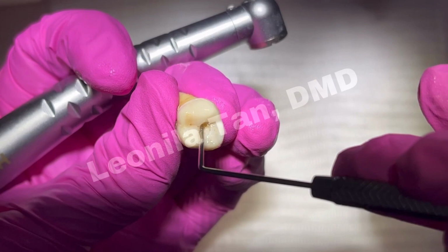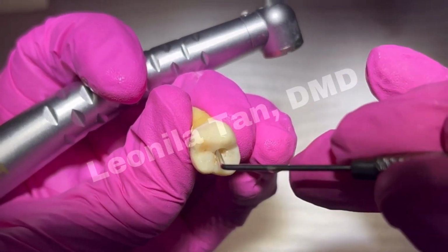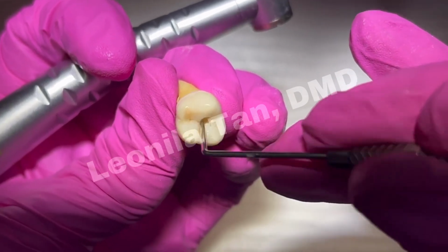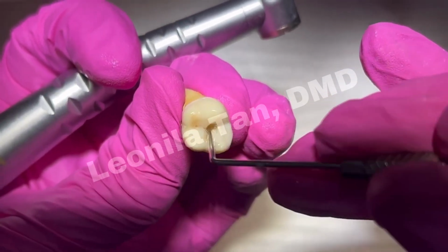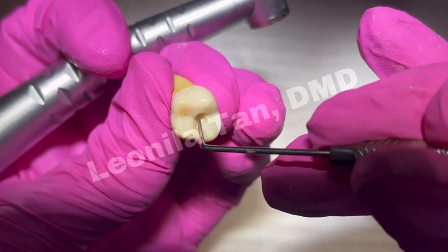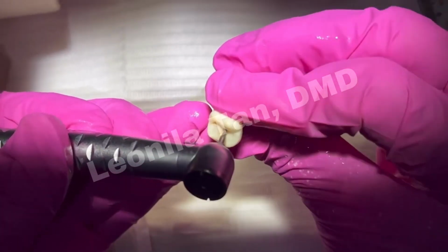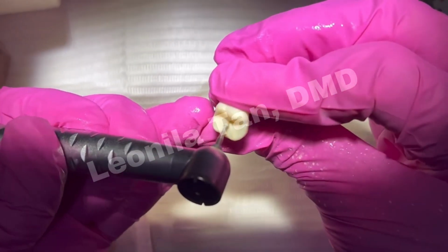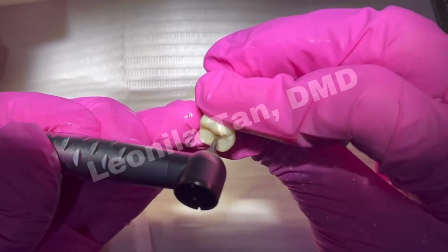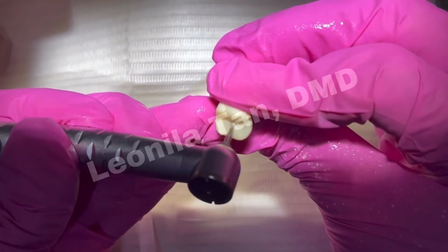At the same time, you want to probe, or you want to feel the area where your Explorer wants to enter, because the roof of your chamber is now thinning out. As I said, you look always at how much of your burr is still out. You're still at that safe depth.